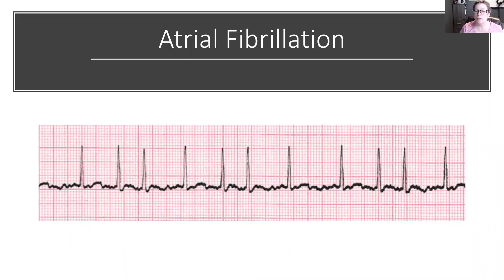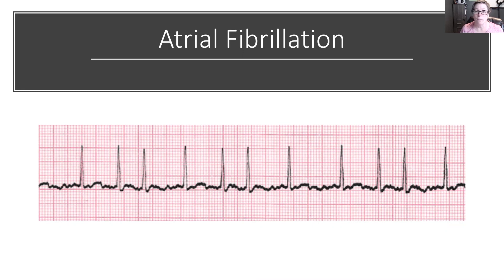In this section, we'll be looking at atrial fibrillation. Atrial fibrillation is a rapid, chaotic, unorganized rhythm. What probably stands out to you just looking at this right now is that the underlying isoelectric line is all irregular — it's like someone has taken a pen and just squiggled lines all the way across. That is a characteristic feature of atrial fibrillation. We call that either fine fibrillatory waves or coarse fibrillatory waves. Fine just means they're really small and coarse means they're a little bit larger.